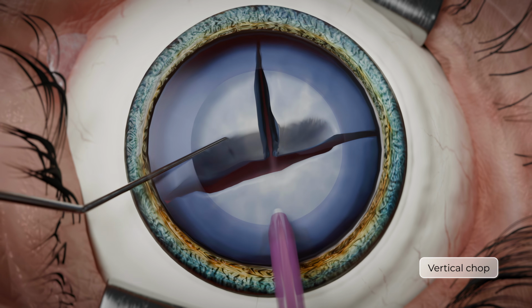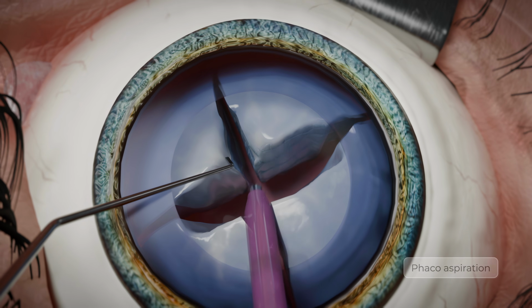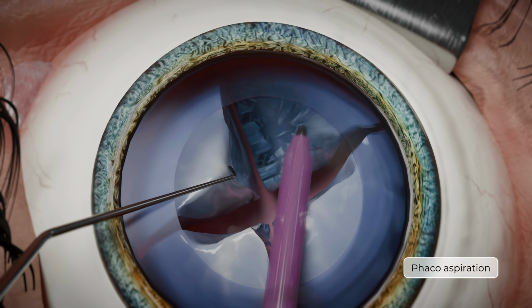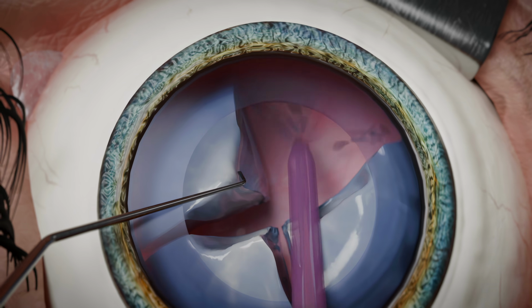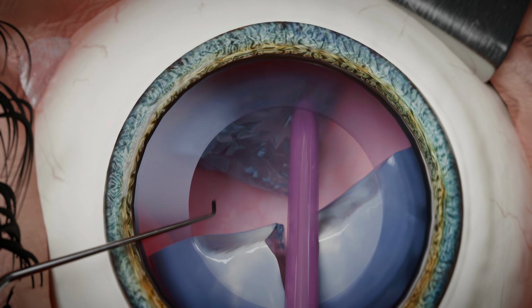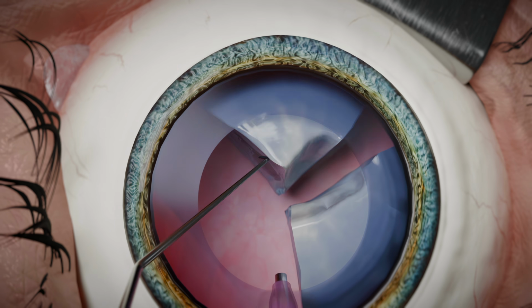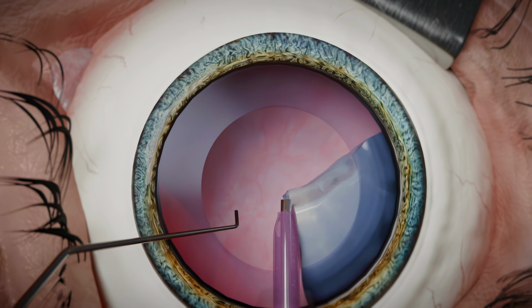In the next stage, the chopper is used to rotate the divided nucleus by 90 degrees, and the chop technique is used to further divide the nuclear fragments. Then, in aspiration mode, each lens fragment is sequentially engaged with the tip of the phaco needle and brought to the center of the capsulorhexis plane, where it is emulsified ultrasonically, with larger fragments divided as needed.